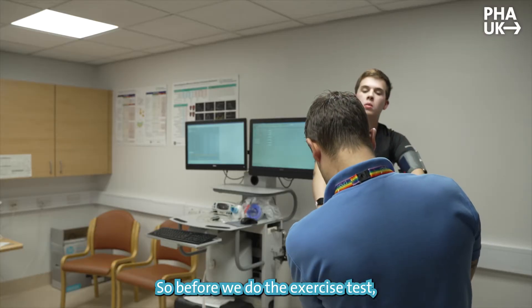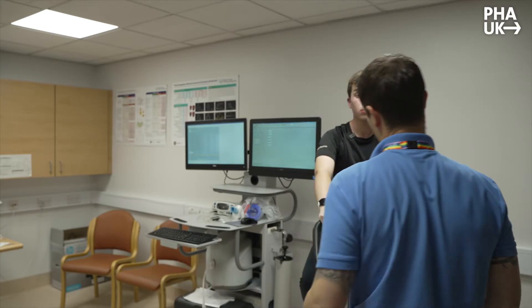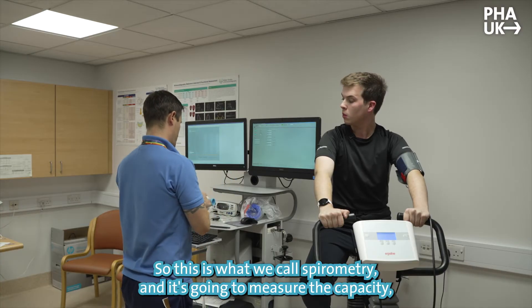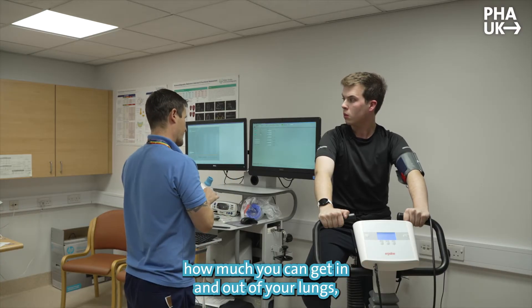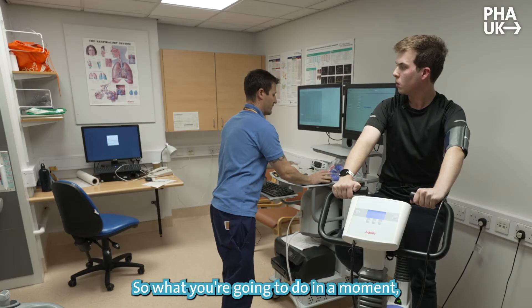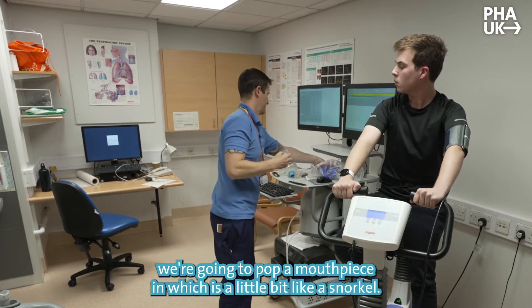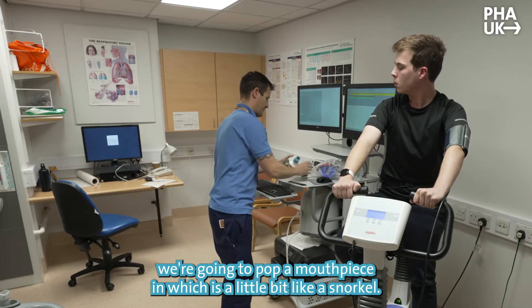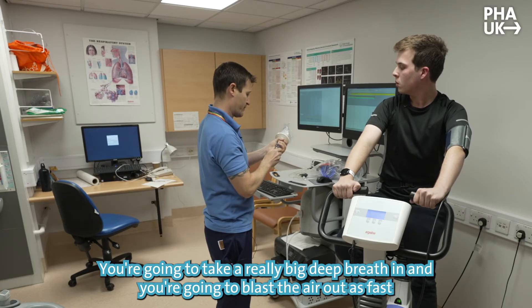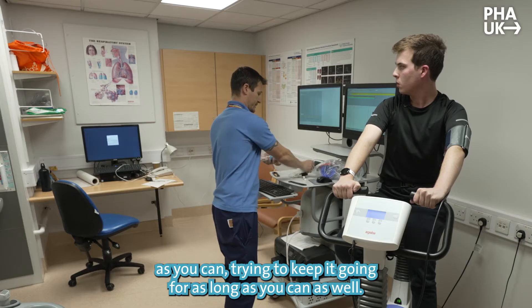Before we do the exercise test, we're going to do a quick breathing test just to get a measure of your breathing capacity at the moment. This is what we call spirometry — it's going to measure the capacity, how much you can get in and out of your lungs, but also how fast you can blow the air out. You're going to do a couple of normal breaths, then take a really big deep breath in and blast the air out as fast as you can, but try and keep it going for as long as you can as well.